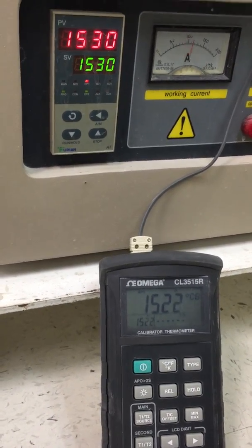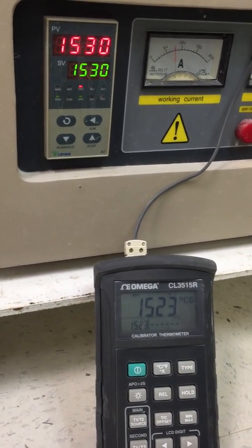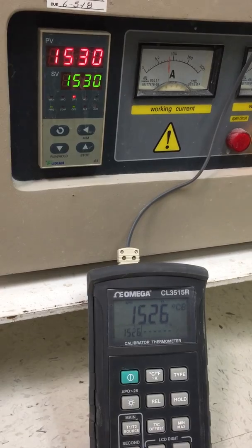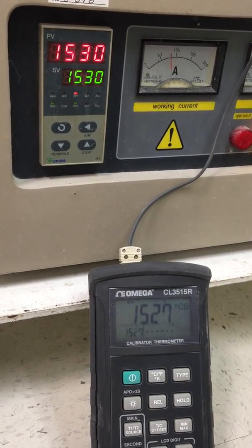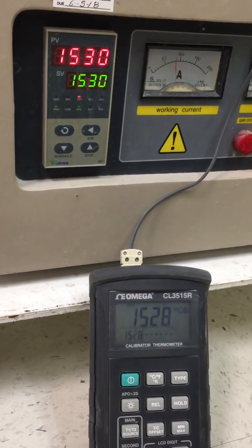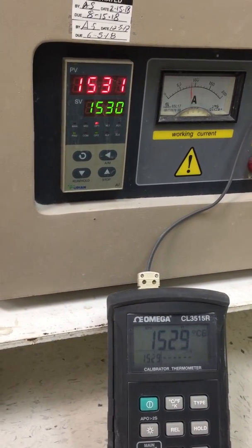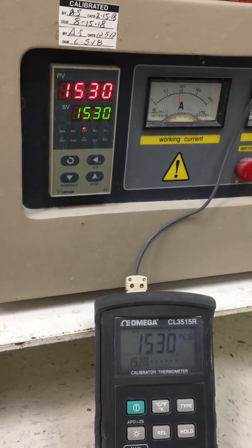Unless you've replaced a thermocouple — then you have to calibrate again, because every thermocouple is slightly different. It should be plus or minus just a few degrees, but you want to be that accurate. It's still rising, so you don't want to touch anything until it's almost not moving at all. This one is probably almost perfect, if not plus or minus two to three degrees.